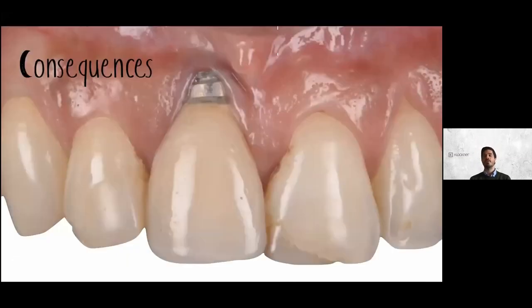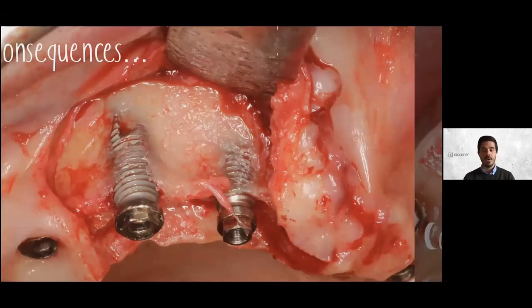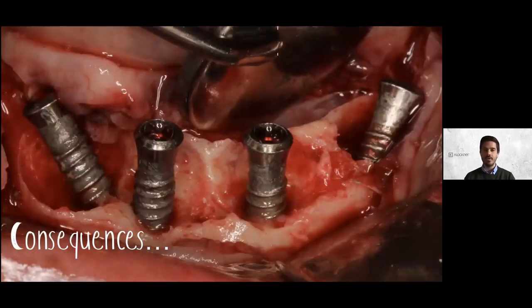Why is this important? Because we are finding situations more often like this, or like this, or like this, where even the best implant that you can place can have periimplantitis if you don't take these conditions into account. You have to plan, you have to think before placing implants what you want to achieve in a long-term prognosis, not only in the early time, in the middle-term prognosis. We have to go further, we have to move further in time, to the long-term prognosis of our treatment. And this is important to take into account.